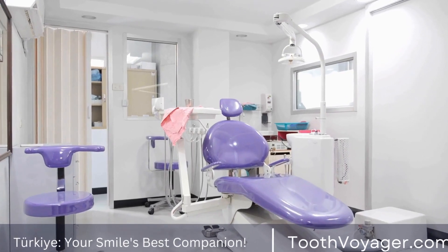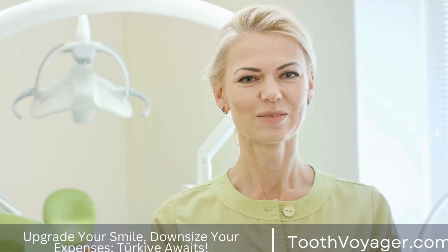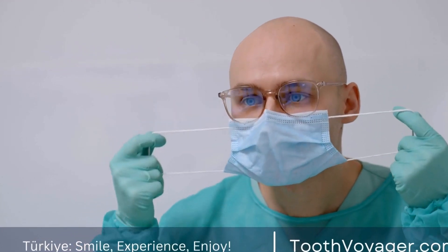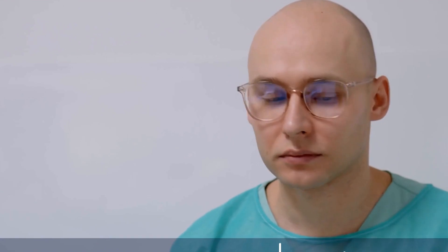Dental Bridges: What You Need to Know About Their Installation. When it comes to replacing missing teeth, dental bridges are a popular and effective solution. In this video, we will discuss everything you need to know about dental bridges and their installation process.